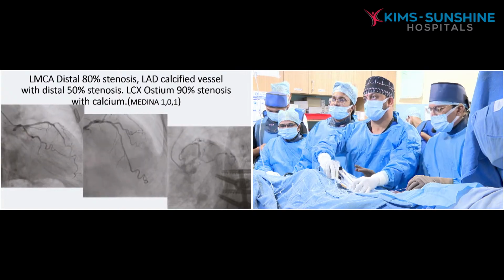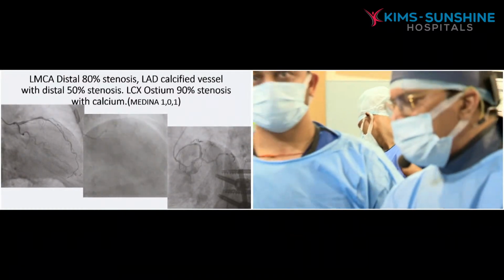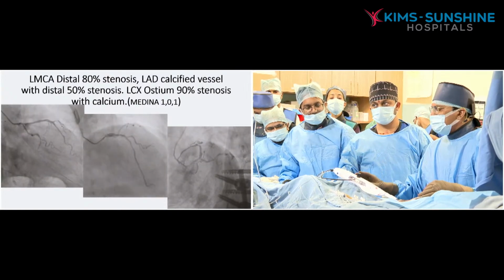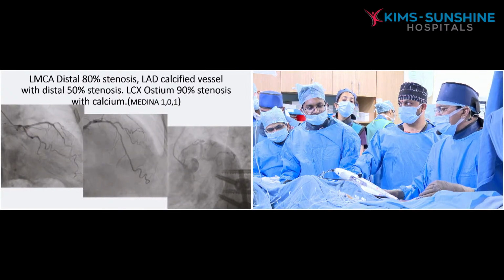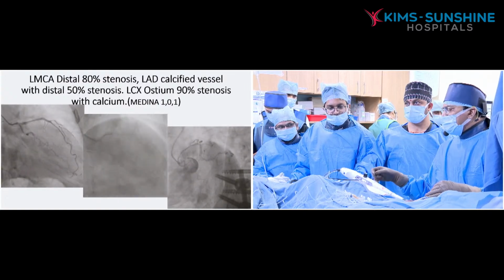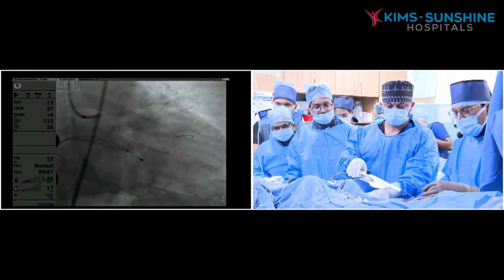Now let me show the components of the advancer. So you have a knob. Once you press, it will be on. Then if you want to switch it off, press again and rotate it. And this is the Dynaglide. Here also there is another glide. This is a brake and a brake defeat. If you want, while doing, just remove this. That's where we have already checked the ROTA Pro movement.